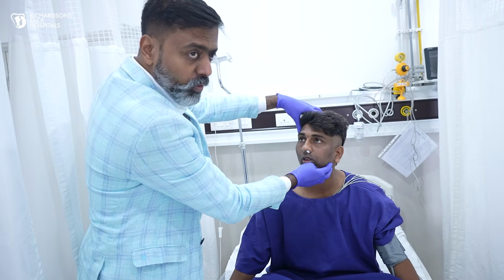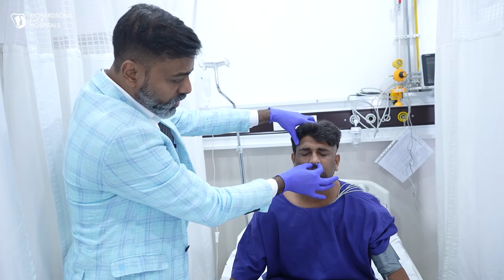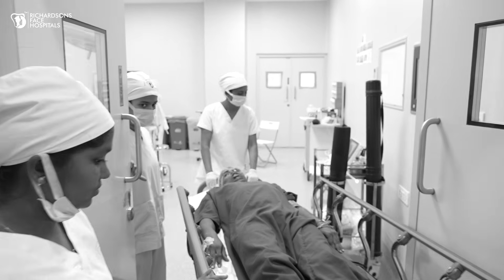So we're going to take care of both his functional and aesthetic concerns in one go. We've got some gauze inside with some medication because we're going to be doing blind nasal intubation for him, and this is going to take us about 5 hours. His right side of the face is deviated to the left and there is a retruded chin.